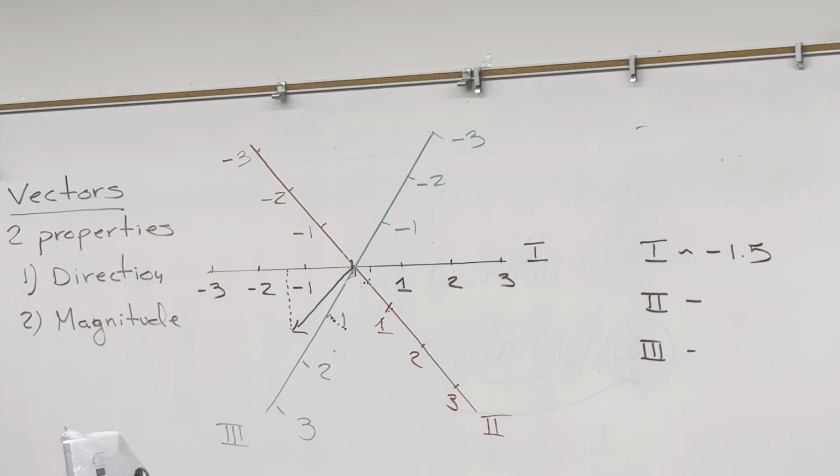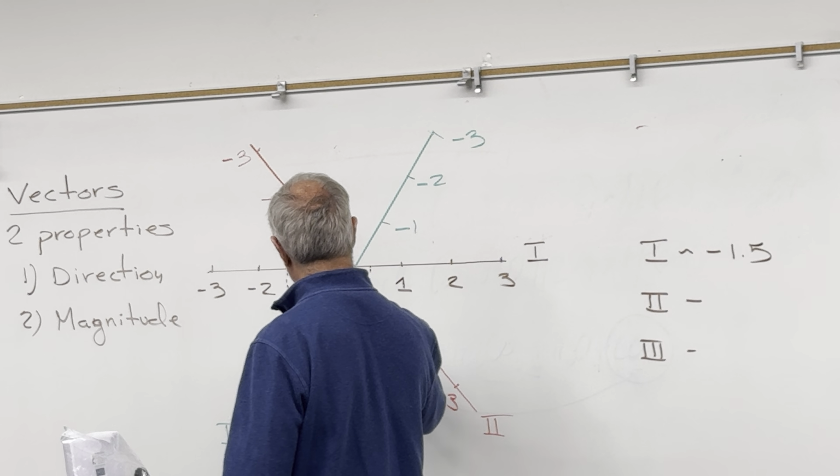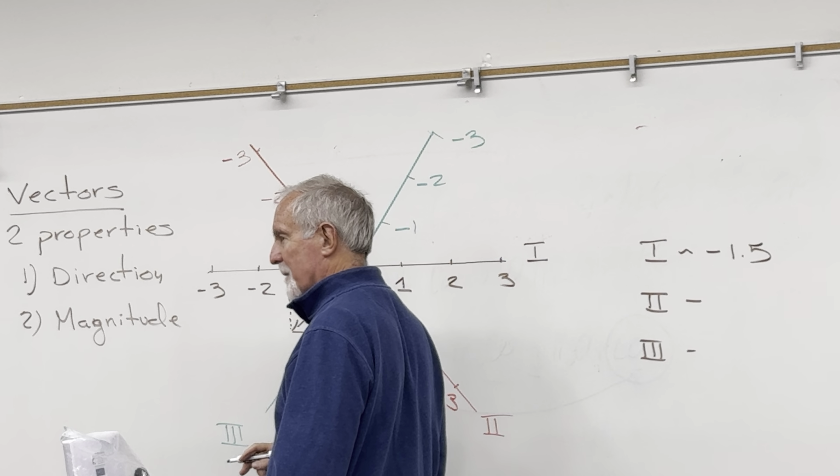Mr. Vargas, what do you have for lead two today? Negative 2. Here's what I'm thinking, is that I've got to take this point and draw a perpendicular line to that axis. And there's no way it gets me to minus 2.